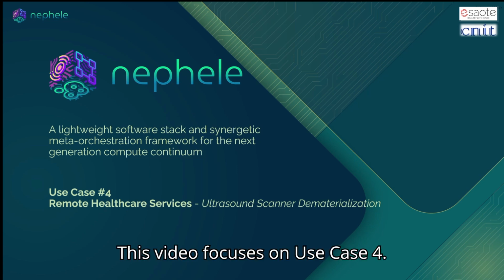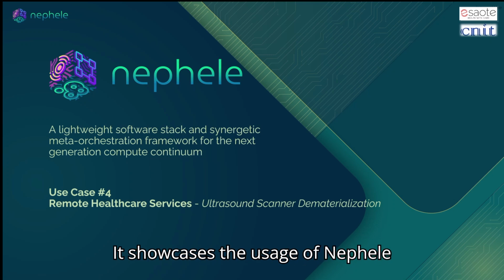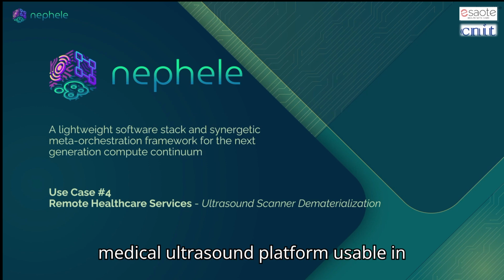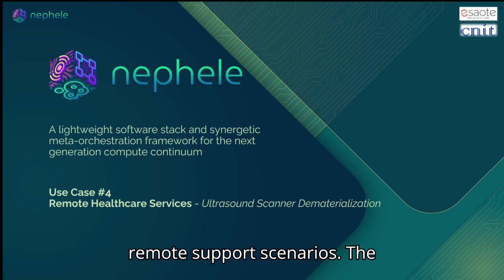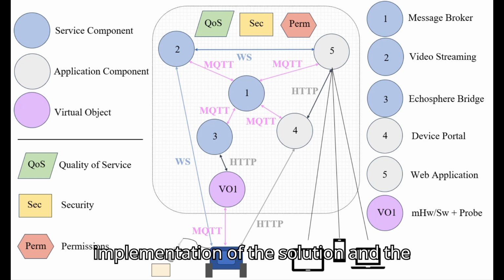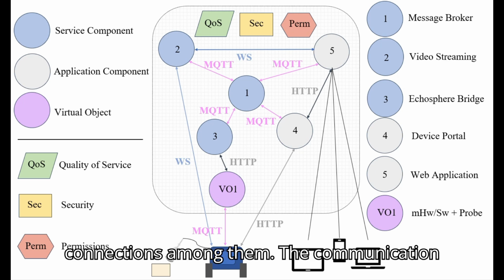This video focuses on use case 4. It showcases the usage of Nephele infrastructure to build a dematerialized medical ultrasound platform usable in remote support scenarios. The application graph describes the application components involved in the implementation of the solution and the connections among them.